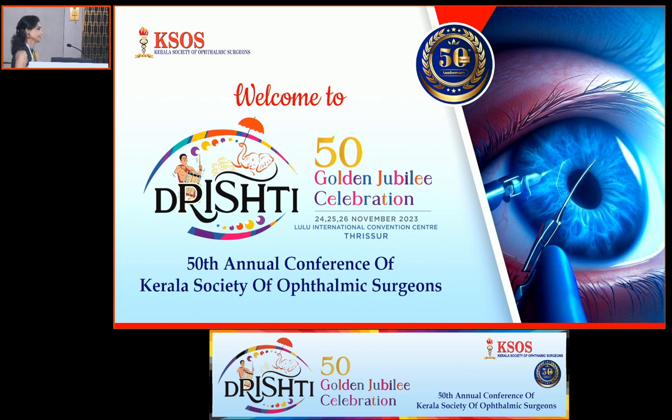How about, do you do peripheral iridectomy? Iridectomy. I don't do iridectomy in routine cases because I'm putting it in the bag. Even if I'm putting it in the sulcus, I have a good posterior capsular opening. It's very unlikely to cause a postoperative glaucoma.